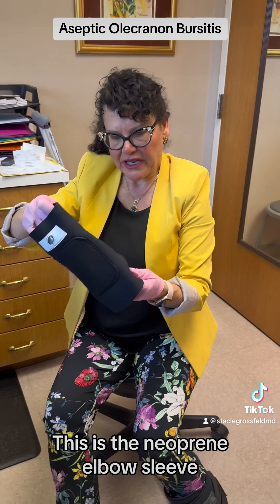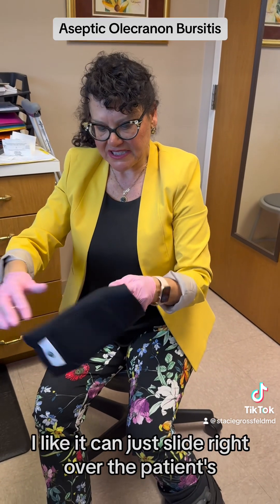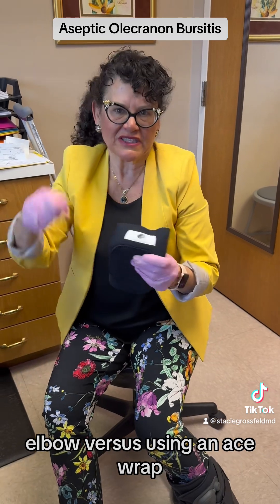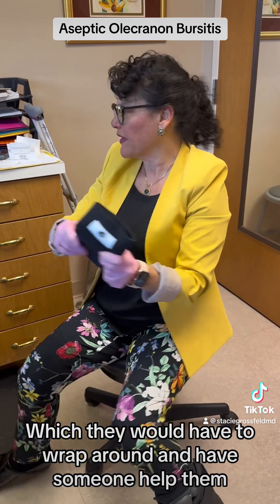We'll get a band-aid and put a compression dressing on him. This is the neoprene elbow sleeve I like — it can just slide right onto the patient's elbow versus using an ace wrap, which they would have to wrap around and have someone help them with.